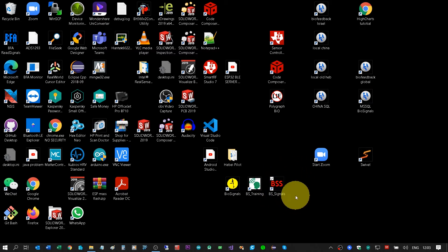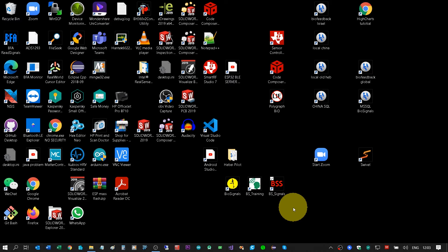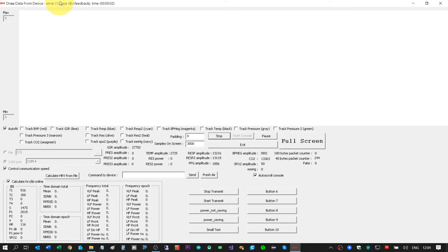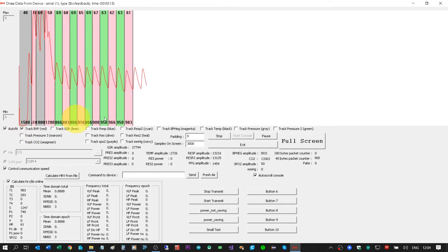Let's continue to the next application — BS Signals. This application is different but does a similar job: reading signals from the hardware, displaying graphs, and saving signals inside CSV files. I will double click on the icon and get the technical software. When I click Start Monitor, it will communicate with the hardware and start reading signals. I can see my serial number.